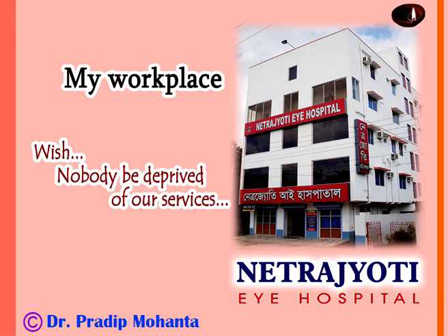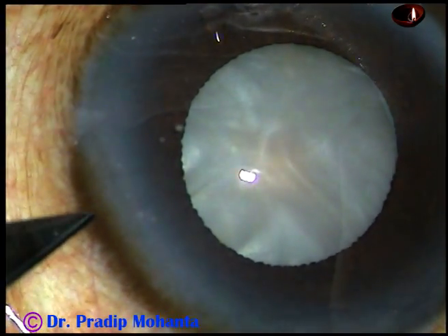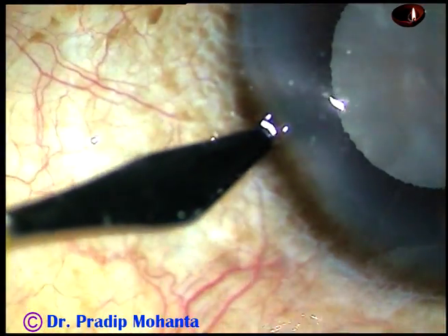Dear colleagues, welcome to my workplace at Rana Ghat, West Bengal, India. This is an intumescent cataract. In this case, I am going to use Faros from Oertli, Switzerland.